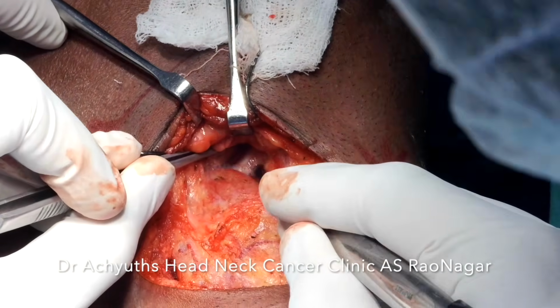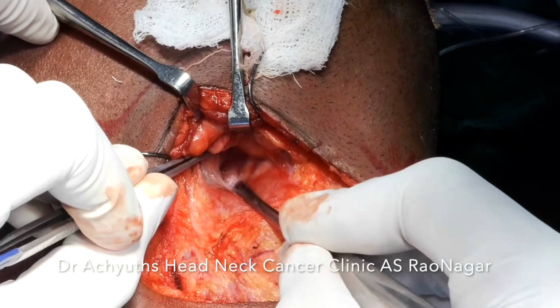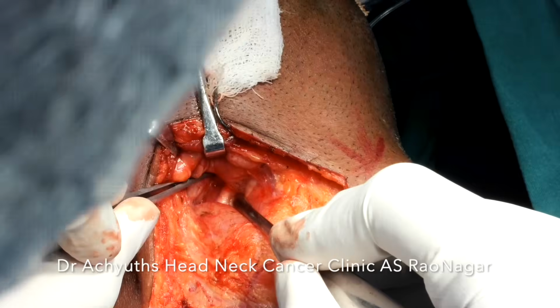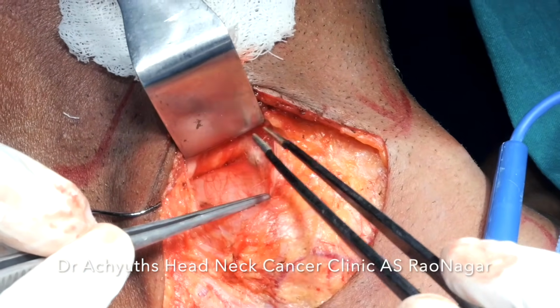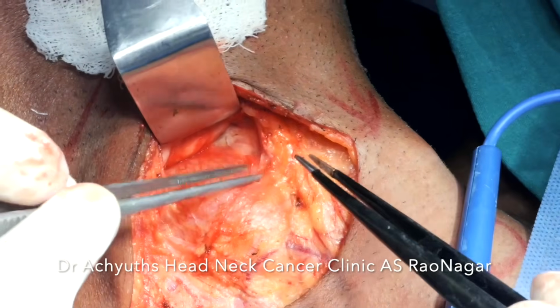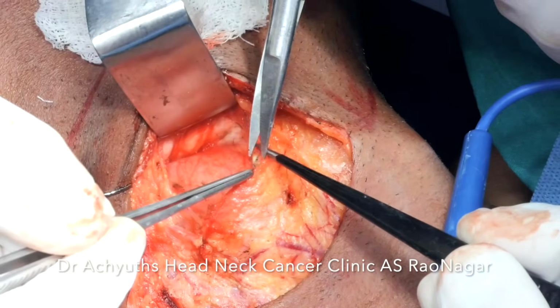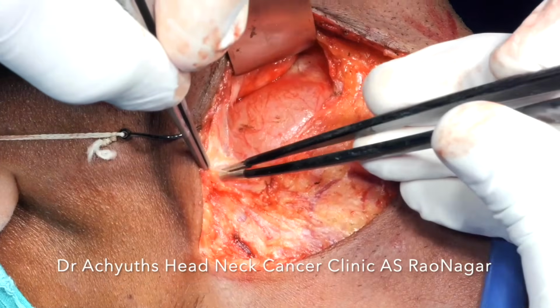So basically we are lifting even the deeper part of the submandibular gland, which is hooking around the mylohyoid muscle. In this kind of dissection we don't see the mylohyoid muscle because both the superficial part and the deep part of the submandibular gland, they are very much intact. So we just try to raise the submandibular gland and try to divide the posterior belly of the digastric and its facial attachments from the cyst. That's all.